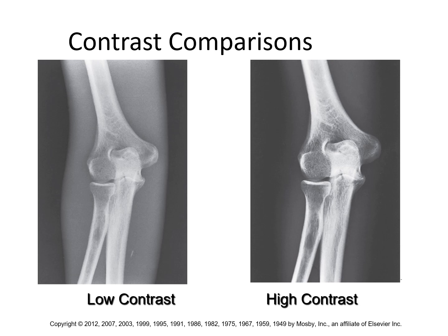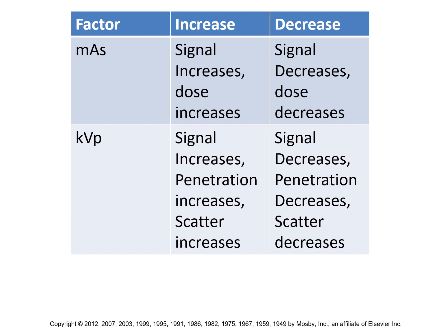But go ahead, count the colors on the right. See if you come up with a number greater than 5. I don't think you will. I think it's either 4 or 5. I've done this before with the students in a live scenario, and we all typically agree that there's about 7 or 8 individual colors that are unique on the left-hand side, about 4 or 5 colors on the right-hand side. All right, so here's a handy little table.